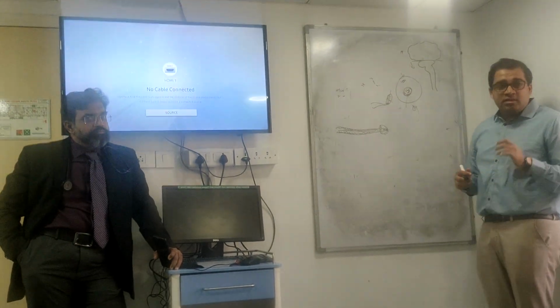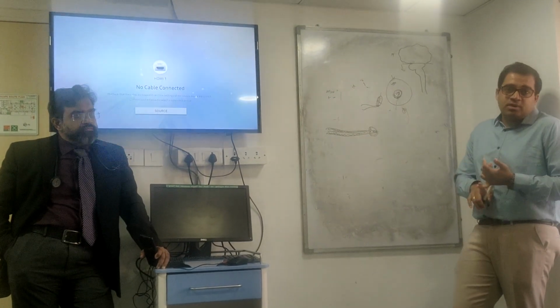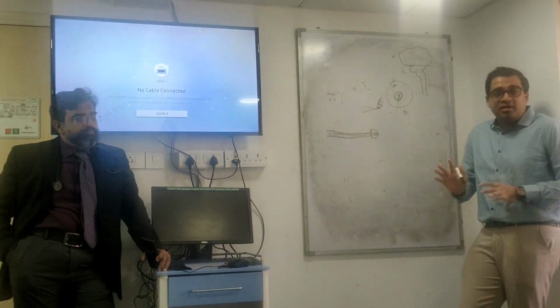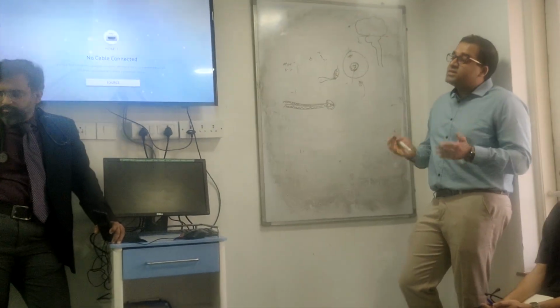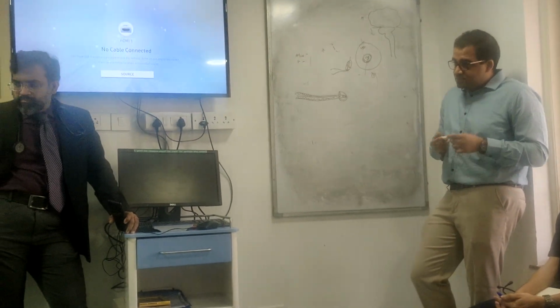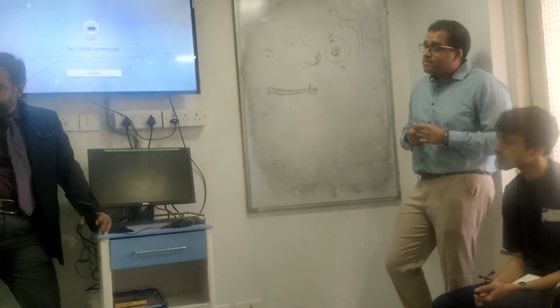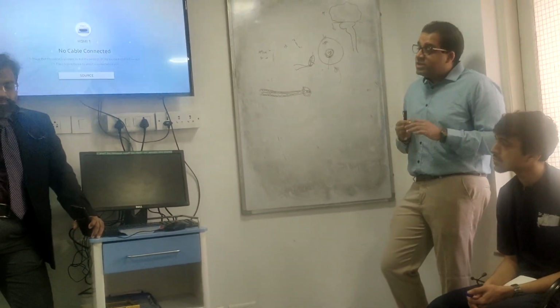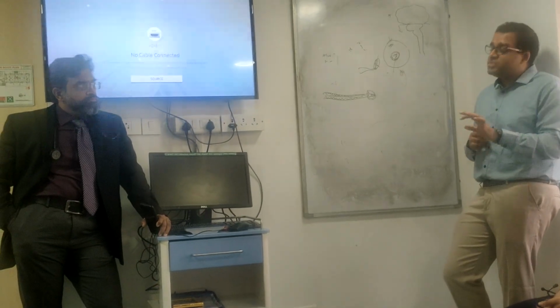You should ask them, see, don't discard this bottle. Then they ask, कितना दिन रखना है? So ask 10 days. 10 days में negative है, then it is actually negative. We should be doing this for suspected sepsis with no other answers. We will be knowing only after 3 days that there is no organism. They will keep it till day 5. 120 hours होने के बाद ही bottle discard करेंगे till there is no growth.